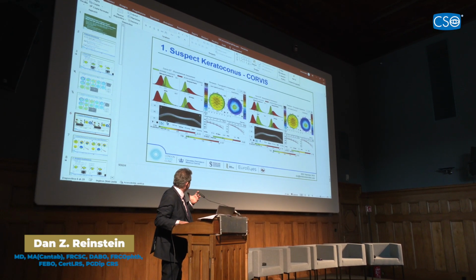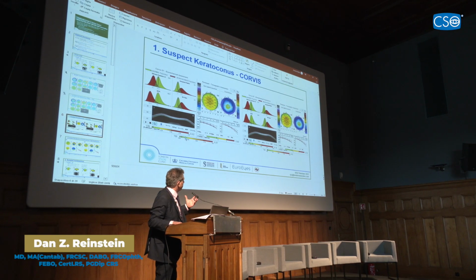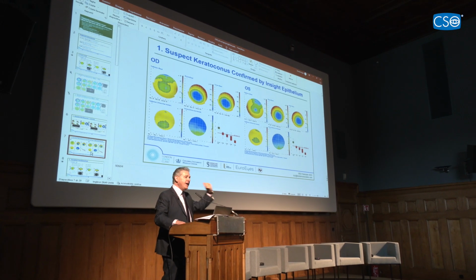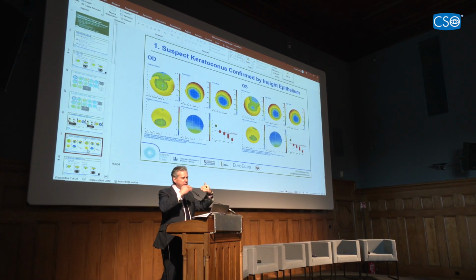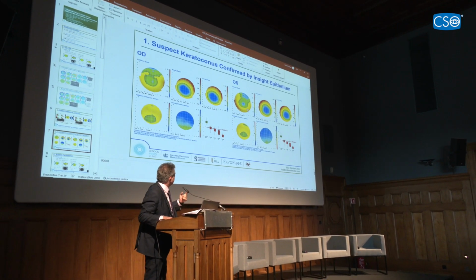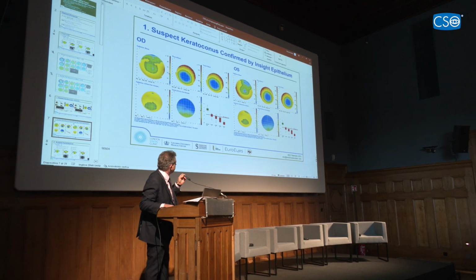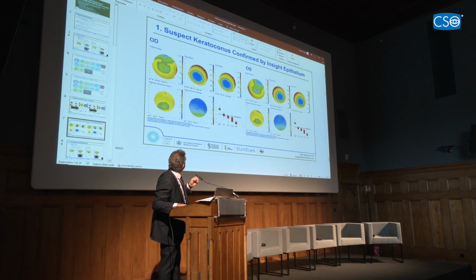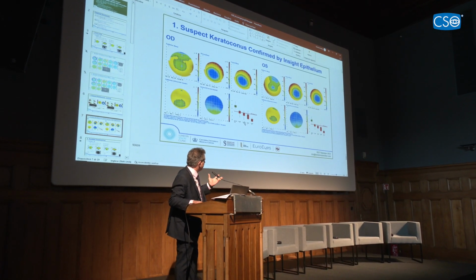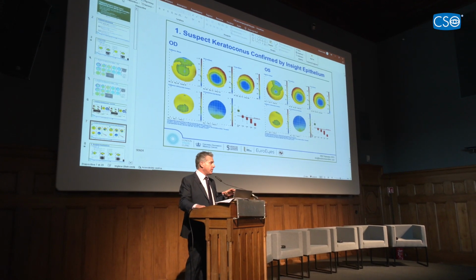and we are using the Corvis, and now we know that this cornea is quite stiff, and the TBI is certainly completely normal, so low susceptibility. But on final screen, because a case like this, we escalate to the diagnostic power, and then we go to 1 micron precision on the epithelial maps, and we find that there's actually very, very intense focal thinning of the epithelium in a certain spot in the center, and the COMC calculator, which is an AI calculator, actually classifies this epithelium as keratoconic in both eyes.